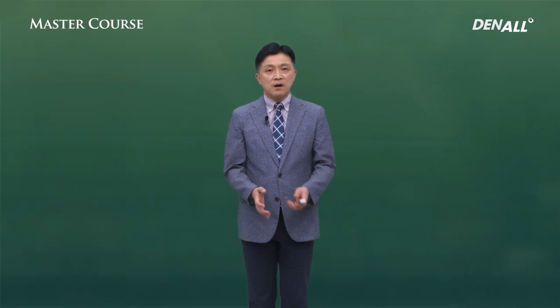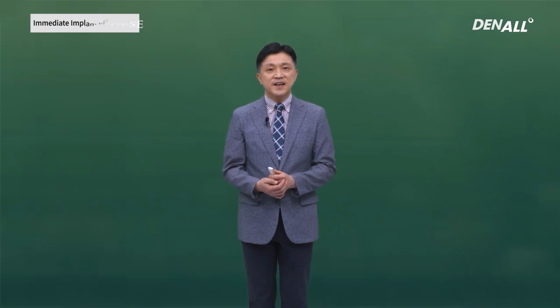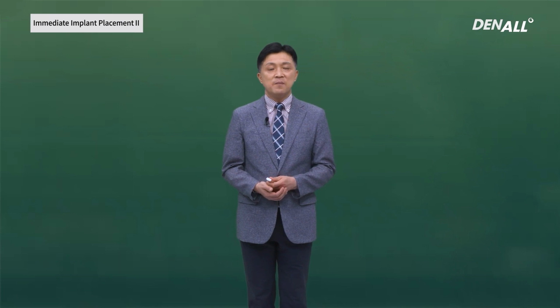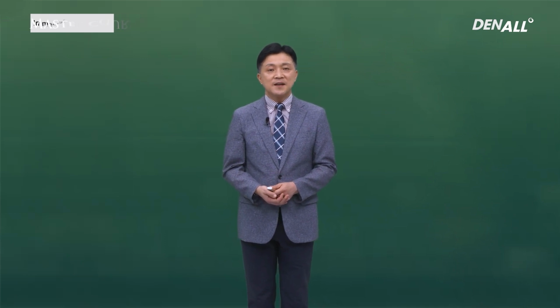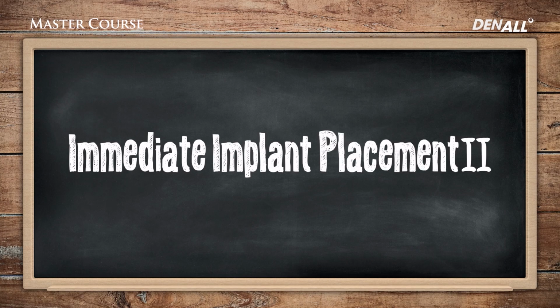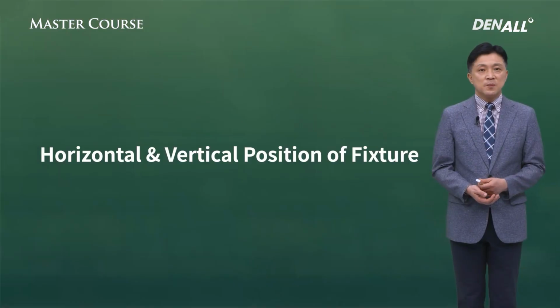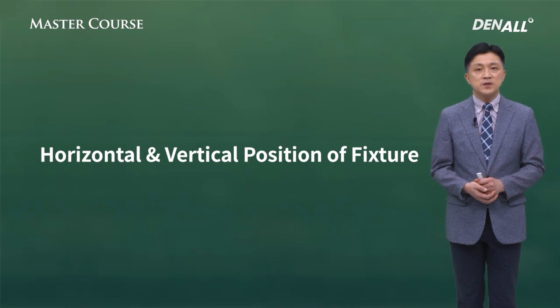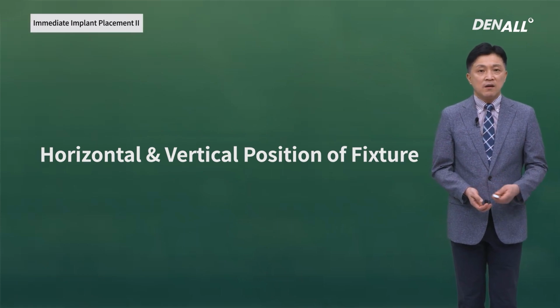In this lecture, I'm going to talk about immediate implant placement following the previous lecture. I'm going to talk about the three-dimensional position of the implant and how we should manage the gap. When we do immediate implant placement, the position of the implant is a very big factor in determining its success.